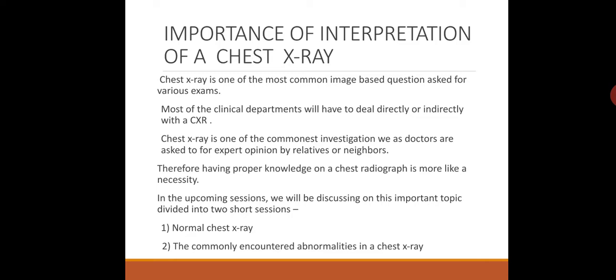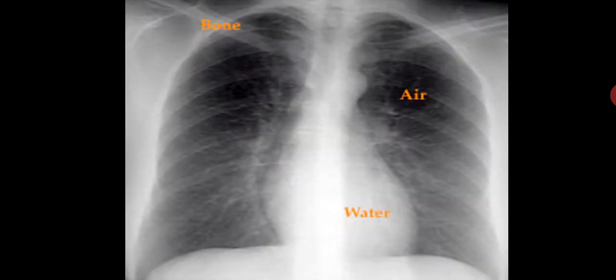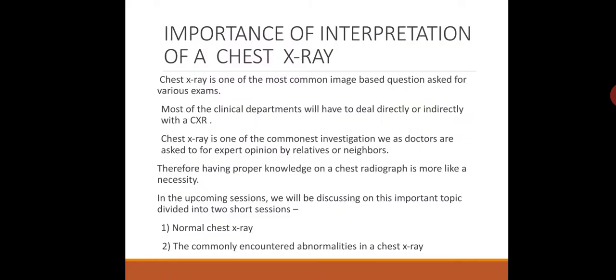In the upcoming sessions, we will be discussing this important topic of reading a chest X-ray, divided into two short sessions. In the first session we will be talking about the normal chest X-ray, and in the second session we will be talking about the commonly encountered abnormalities in a chest X-ray.